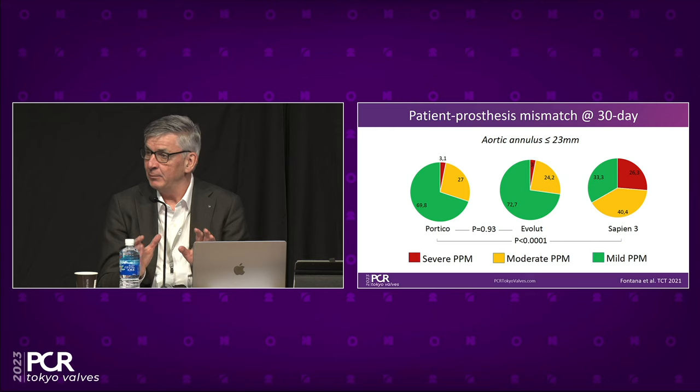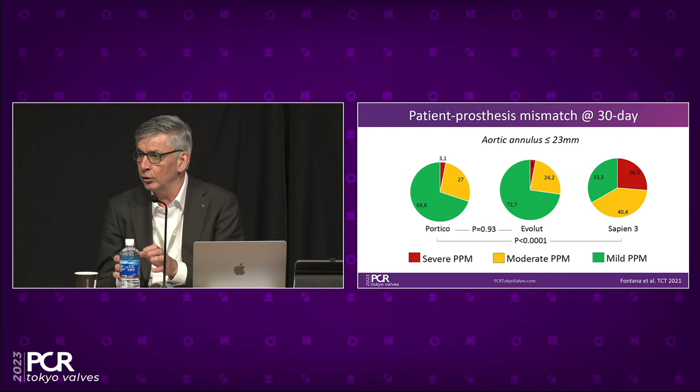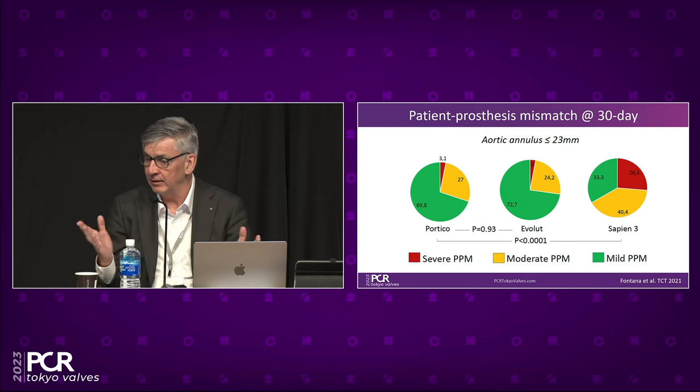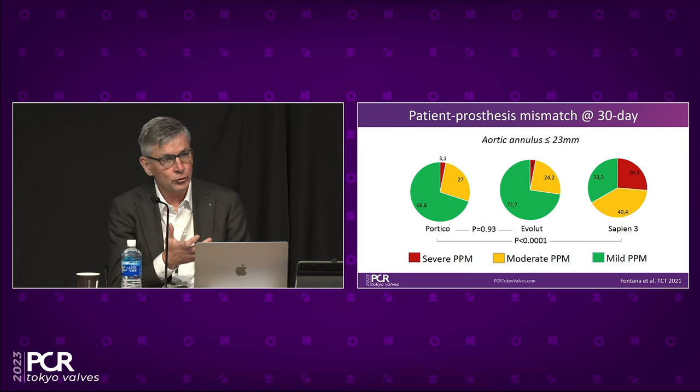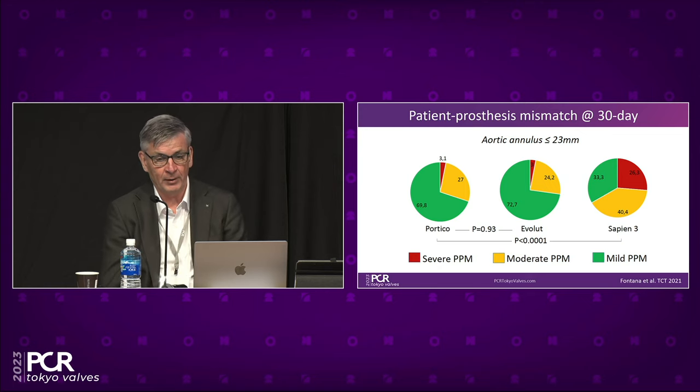Also, maybe very important here, you can see there's no difference between self-expanding technology with an intra-annular leaflet position or supra-annular leaflet position. I think it all comes back to the valve design, which Kentaro just explained, how the leaflet can actually open up. So if you choose to do TAVI in these patients, it will also make a difference what kind of platform you choose for the patient.